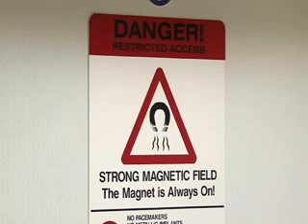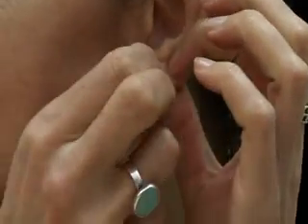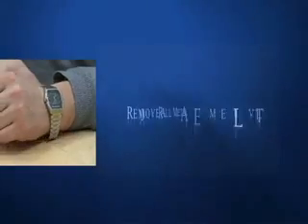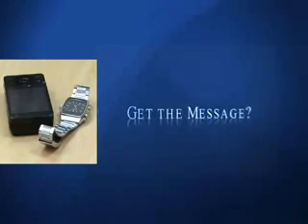There are three things you need to know in terms of safety when approaching the MRI scanning area. Do not take any metallic objects into the area. Do not take any metallic objects into the area. Do not take any metallic objects into the area. And additionally, do not take any metallic objects into the area.